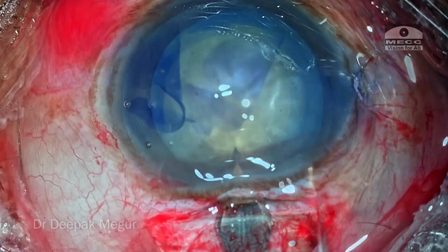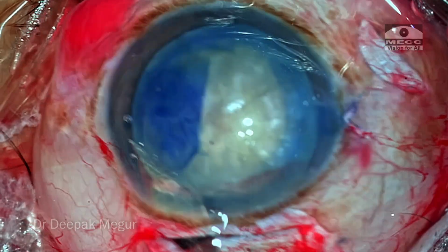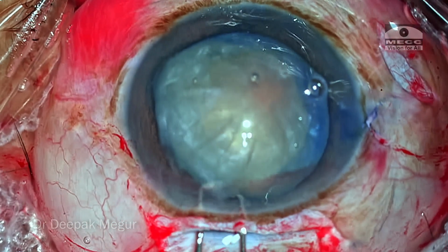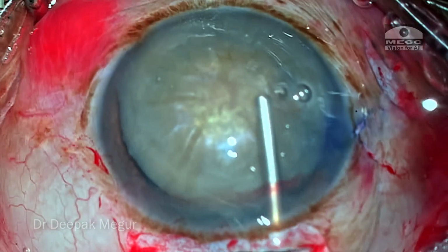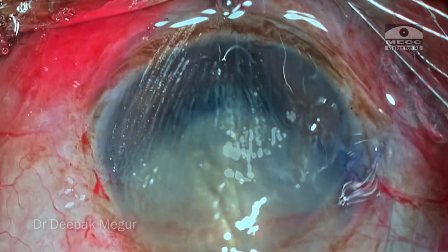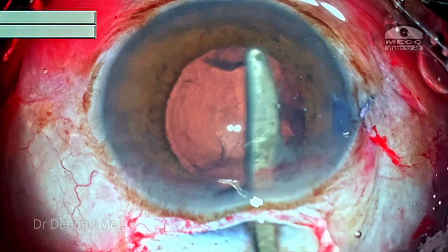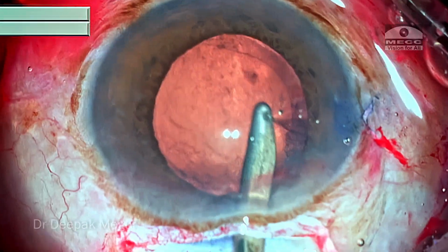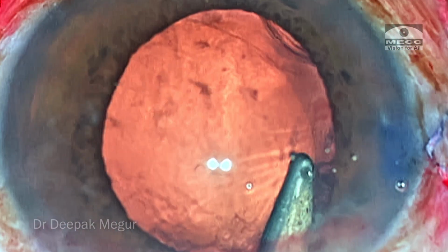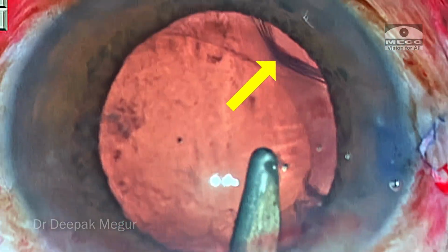The resident surgeon is doing a manual SICS in this case of a mature cataract. The nucleus is mobilized out of the capsular bag into the antechamber, and then it's extracted out using the phaco sandwich technique. So far so good. The surgeon begins his irrigation aspiration, tries to wash off all the debris which are coating the endothelium, and as he begins to aspirate the cortex, he sees there is an area of localized zonular weakness here.